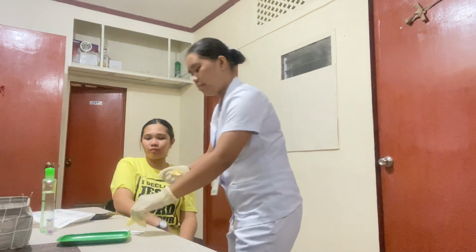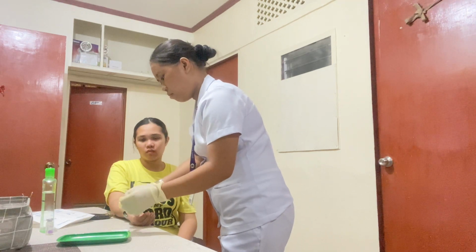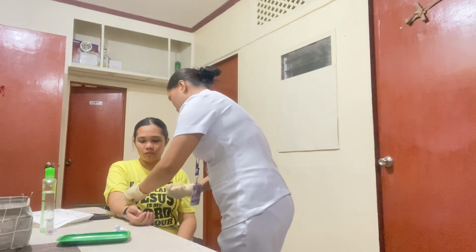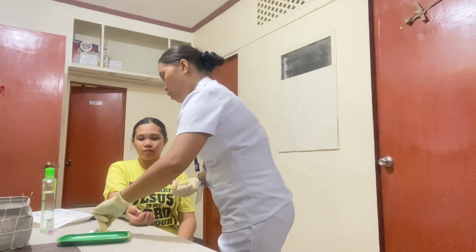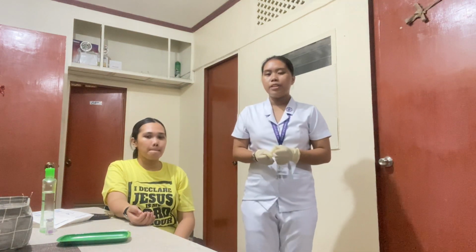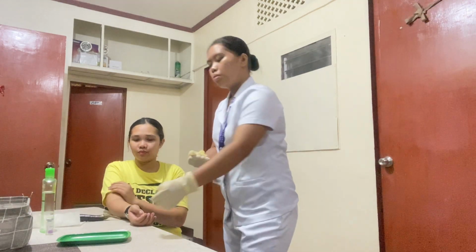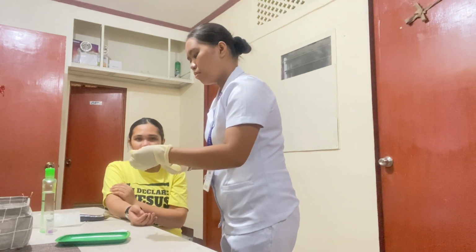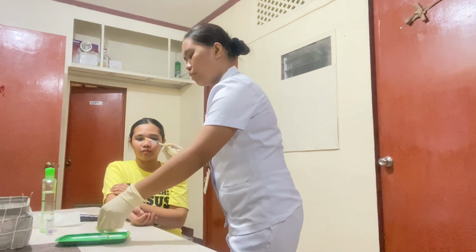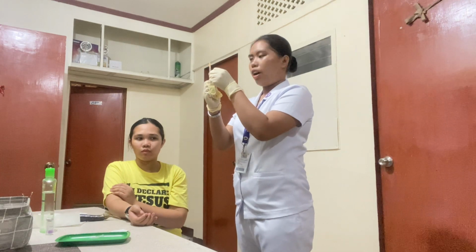Now, cleanse the site of the injection, then dispose of the swab. For preparing the syringe, remove the needle cap. Then expel the air. A small amount of air will not harm the tissue.